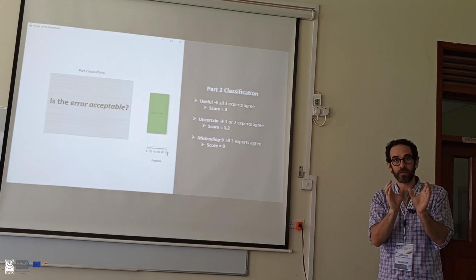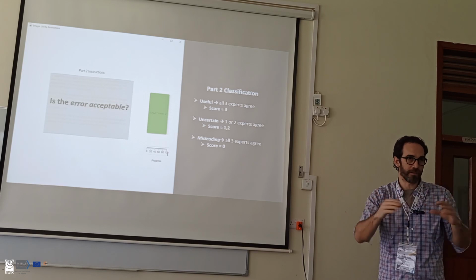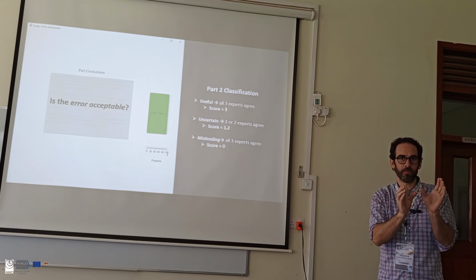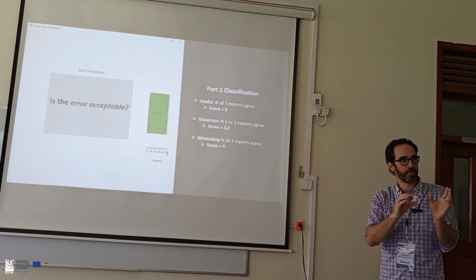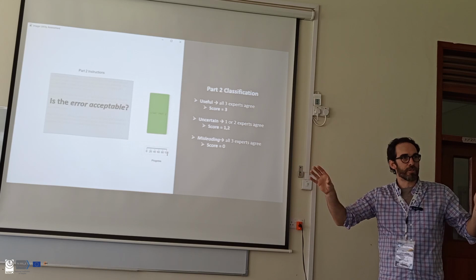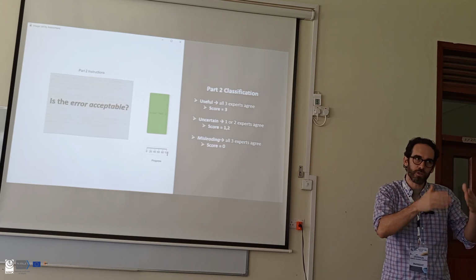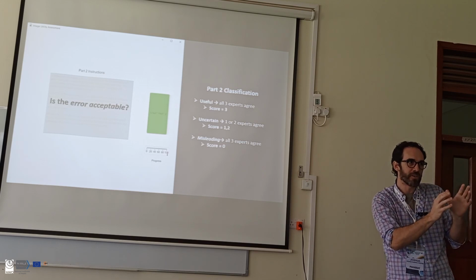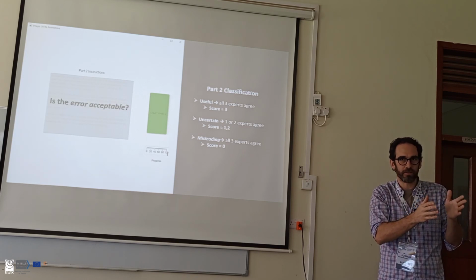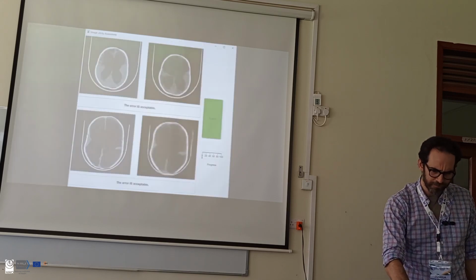So what I was trying to do here is I was trying to probe whether the machine learned images looked beautiful, yeah, they were great, but were they really being true to the biology and the pathology that exists in the real image? This is really important, because anytime you use a library of images to enhance a novel image, you're taking information from something that is not your particular case, and you're guessing, educated guess, right? But you're guessing at what these kind of patterns and noise ought to look like. You're never going to be perfect. It's not possible, right? So we have to know whether there are subtle differences in these enhanced images that could lead to errors. This is the question.